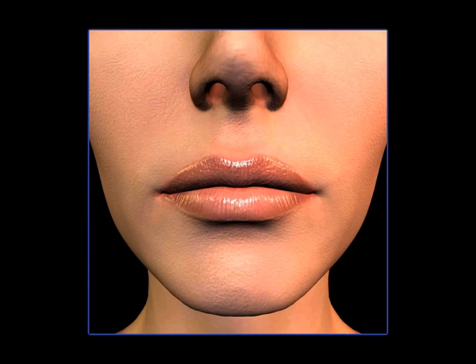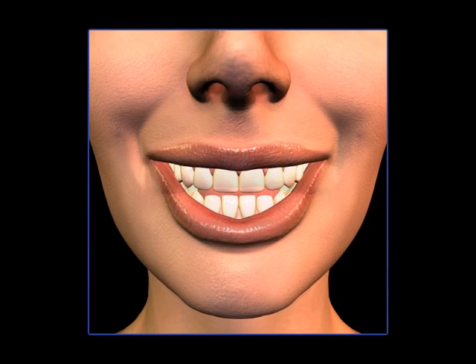This type of bridge can look and feel very similar to natural teeth. Patients that have this type of tooth replacement normally do very well because a fixed bridge looks, feels, and functions almost like natural teeth.